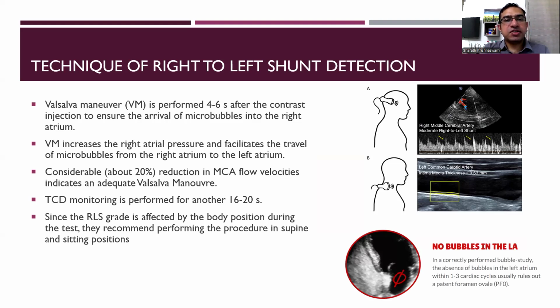How do we know whether the Valsalva maneuver is adequate? When there is a 20% reduction in the middle cerebral blood flow velocity, then it indicates that the Valsalva maneuver is adequate. You continue doing the TCD monitoring for another 16 to 20 seconds.